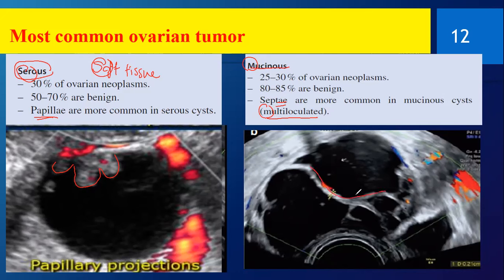Looking at the image, you can see the septa giving a multiloculated appearance. Of course, there will be vascular flow inside to confirm this is a tumor in the first place. The serous cystadenoma would have a soft tissue component — again with a vascular component.